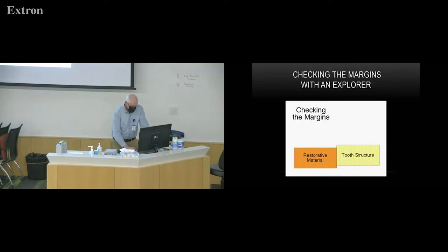And I think I've showed this to you before, but I'll review it quickly. So when you're going from restorative material to tooth structure, and it catches, that means there's a void and you need to add more material.